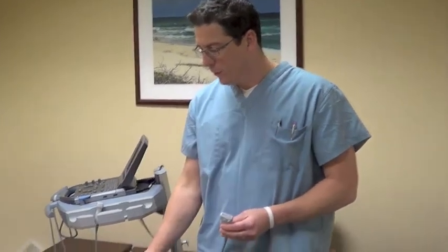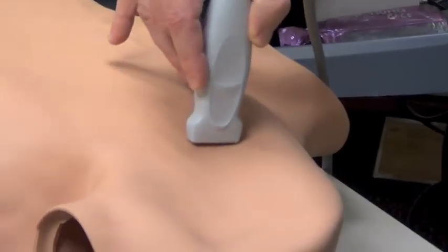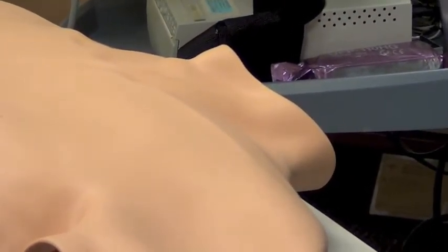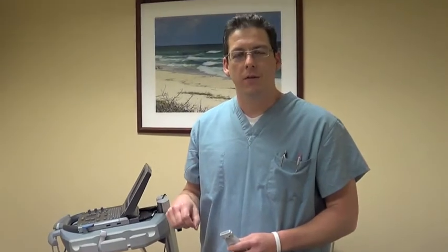Some of the common pitfalls encountered in this procedure have to do with the anatomy of the insertion of the line and actually where it is being inserted into the vein. The further we go laterally on the thoracic cage, we actually get into more of the axillary vein than the subclavian vein. In that position we often encounter issues with what we call tenting — that is to say the vessel can collapse under the pressure of the needle hitting the external wall of the vein.